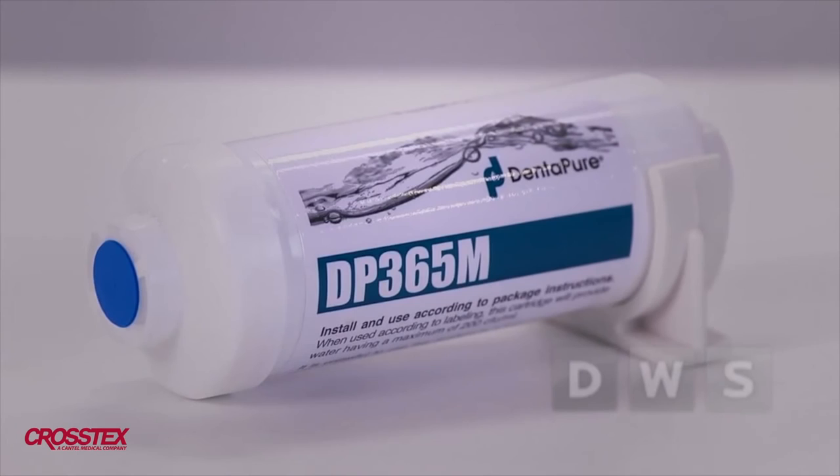We use Dentipure. It is easy to use, cost-effective, convenient, and reliable. This cartridge, installed on the water bottle's pickup line, will deliver clean, clinical water for one full year.